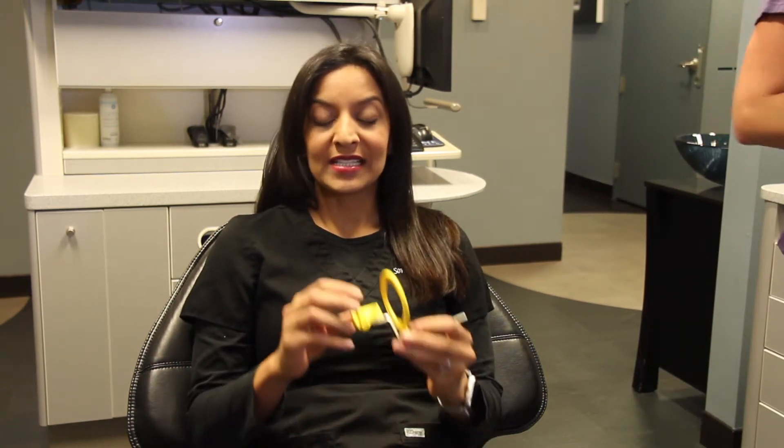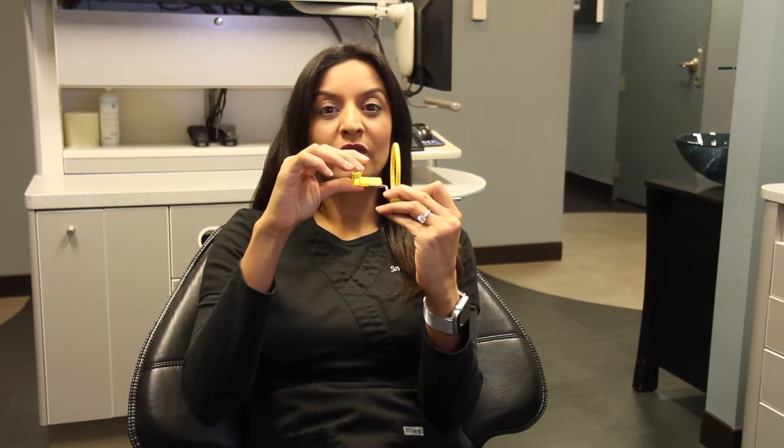You want to make sure that when the patient is biting down, the sensor is not flexing, because this will move the sensor to a different angulation and the angulation of your cone will not match up with the angulation of your sensor. You'll get a change in your vertical angulation which will cause your tooth to be foreshortened or elongated, distorting the pulp chamber. Having two angles will show you different superimpositions of the tooth and give you a full visualization.